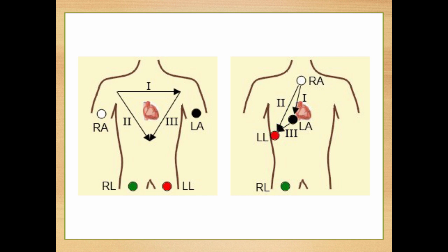Right? So now we've taken Einthoven's triangle that looks all over the heart, and we can manipulate which view we're looking in. This isolates the atria, and I monitor in lead 1 right here, so I've got this direct view just on the atria. So if I do have atrial activity, if I do have flutter waves, if I do have a P wave, there is atrial activity that's hard to pick up on our normal EKG. Now in the Lewis lead, that P wave, that flutter wave, is going to be huge. It's really going to jump out at you. It's just going to be amplified because we have taken our triangle and squeezed it right around our atria.